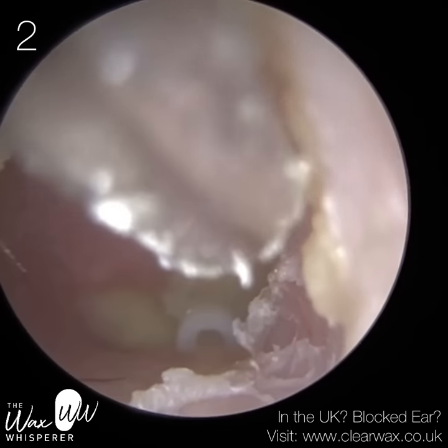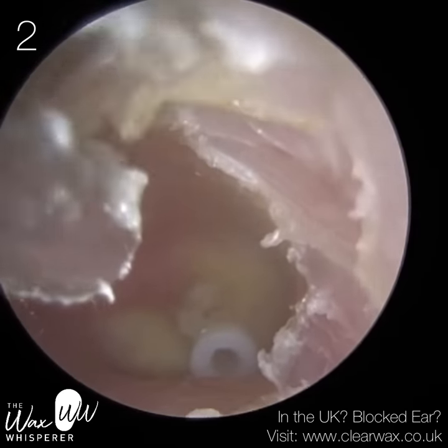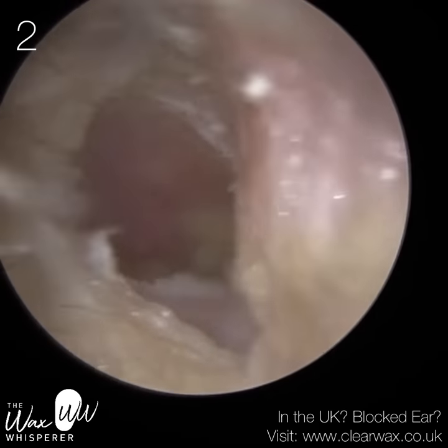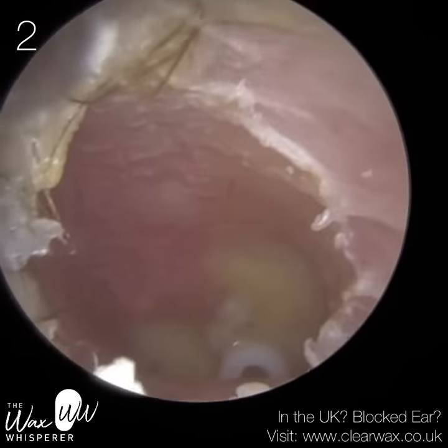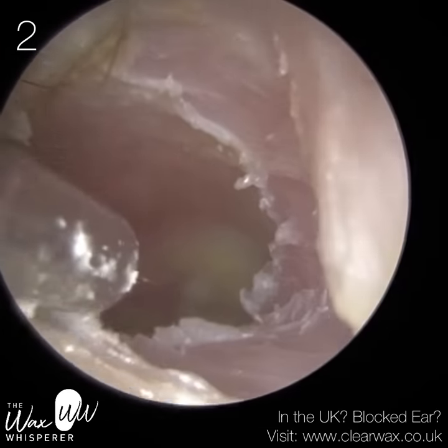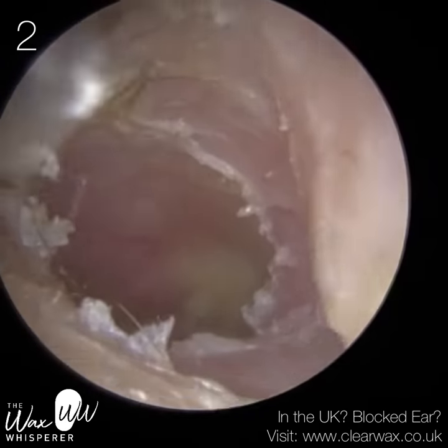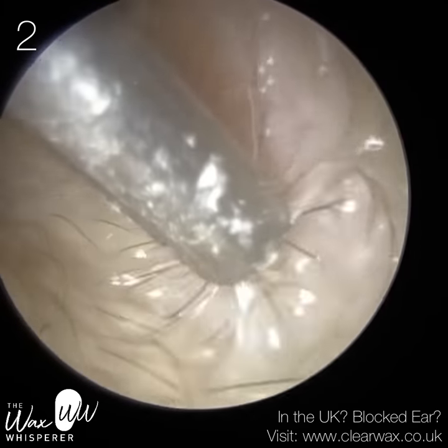The floor of the ear canal — the inner two-thirds, the bony part — is very sensitive. And fourthly, I've got to be careful that I don't inadvertently push the grommet through the eardrum into the middle ear. If I put too much pressure with the suction probe against the grommet, I could potentially push it through, which is the last thing we want. This is her second appointment. My auntie contacted me afterwards and advised she was prescribed oral antibiotics, though I can't tell the doctor what to prescribe.